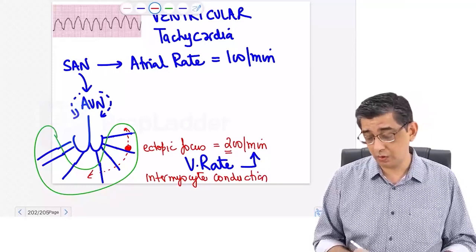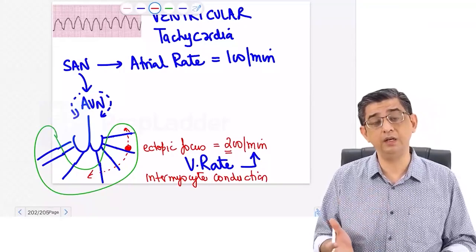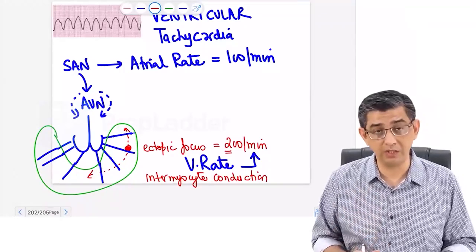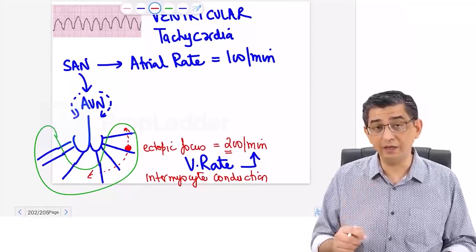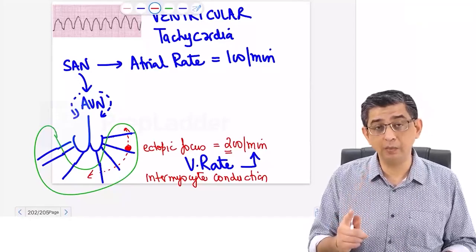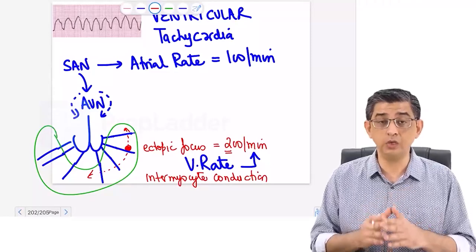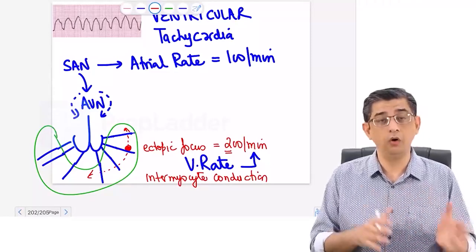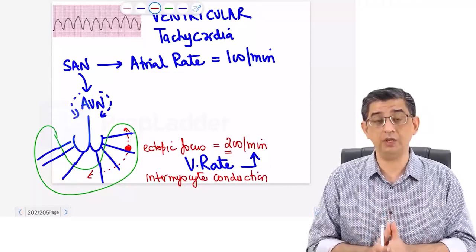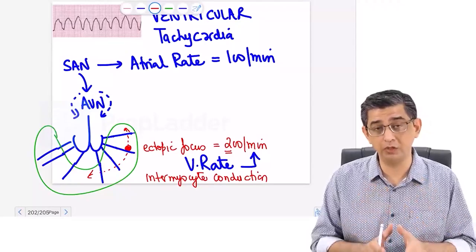On listening to this, the query of most of the doctors is, sir, you were saying ventricular tachycardia. In tachycardia, should it not be a narrow QRS complex? Please appreciate that tachycardia is not decided by the duration of QRS. Tachycardia is decided by the RR interval. If the RR interval is lesser, that implies tachycardia. QRS complex can either be narrow or broad in a tachycardia question. I repeat once again, heart rate is not decided in the ECG by the duration of QRS.